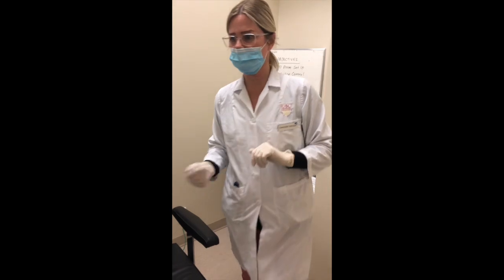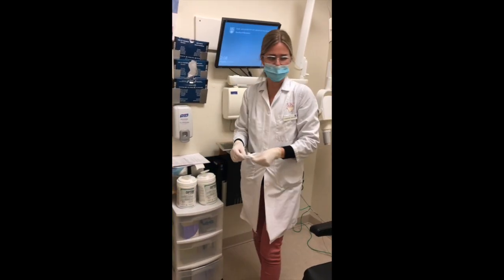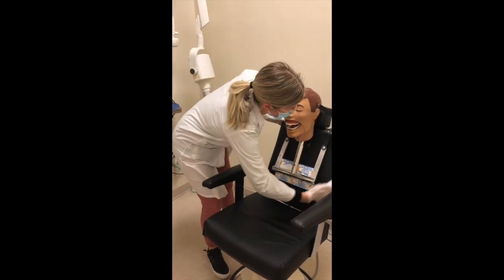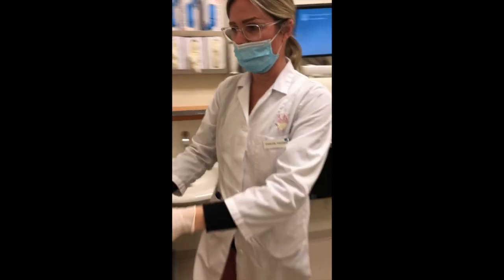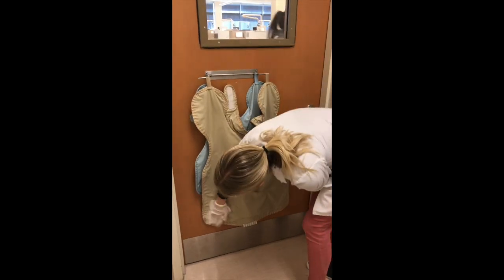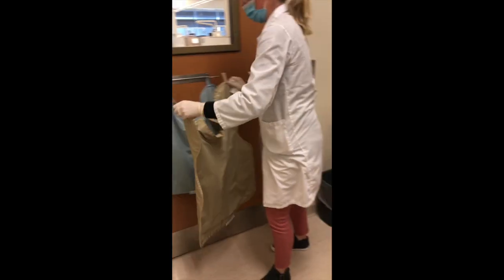Now that my gloves are placed, I'm going to take some disinfectant wipes and go through a complete wipe down of the room. I'm going to wipe down the chair as best as I can. I'm also going to wipe down the lead aprons, both of them, in their entirety along the neck and right along the apron. There are two aprons here, so I want to wipe down the second one as well.